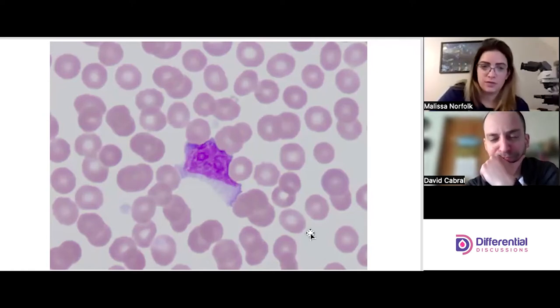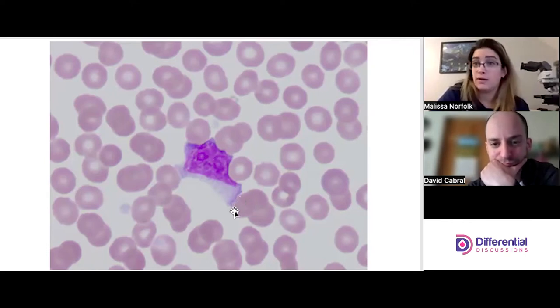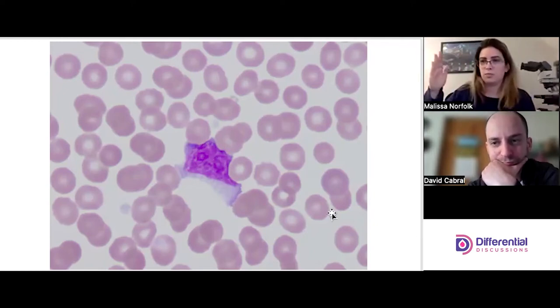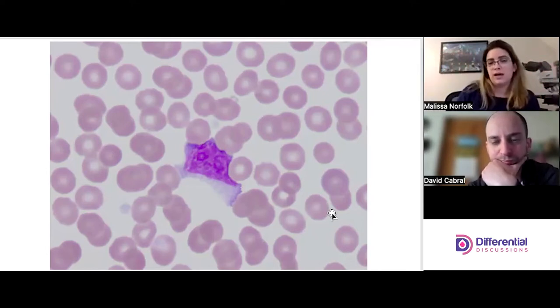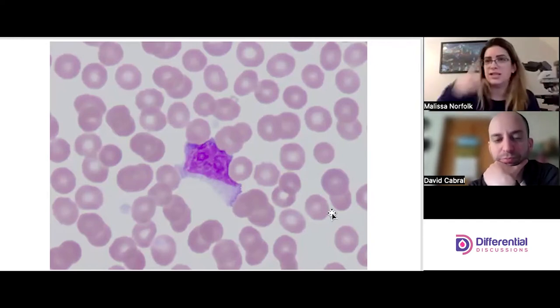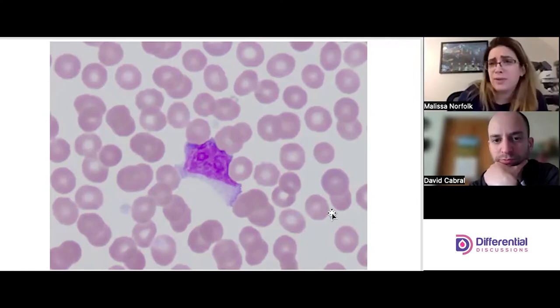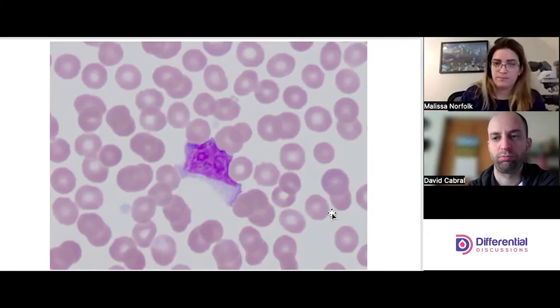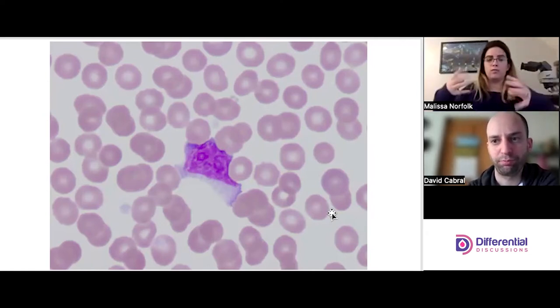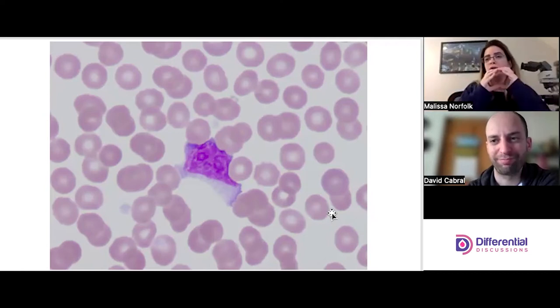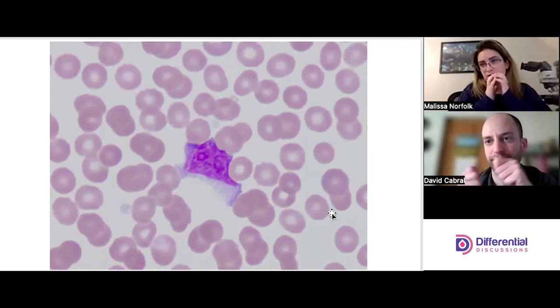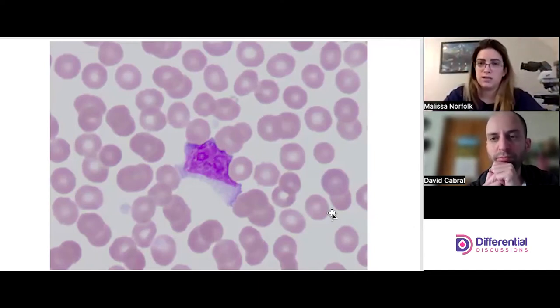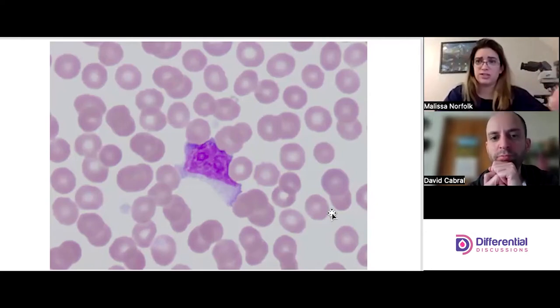Notice how at the edge there's that dark blue — but notice how it radiates inward, shading from deep dark blue to a lighter shade, lighter shade, lighter shade, until you reach the shade of the cytoplasm. That shading is really characteristic of reactive lymphs. Also, remember small round resting lymphs have a nucleus about the size of surrounding red cells — but on a reactive lymph, it's almost like you're taking that nucleus and stretching it. You can really see prominent white striations in the nucleus between those two nucleoli.